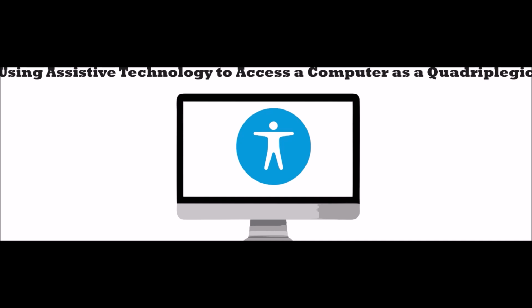As I mentioned previously, my power wheelchair has an adaptive switch built in as part of the joystick. I usually activate my switch when I am playing video games or editing a video. The switch allows me to set up several steps at once. For instance, if I am playing American Truck Simulator, I need to be able to drive and steer at the same time. Thanks to the switch, I am able to accomplish this by pushing diagonally on the switch either in the left or the right direction.